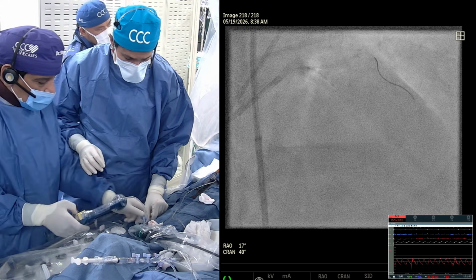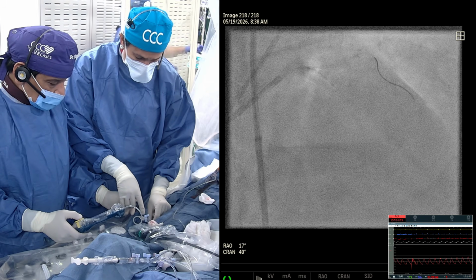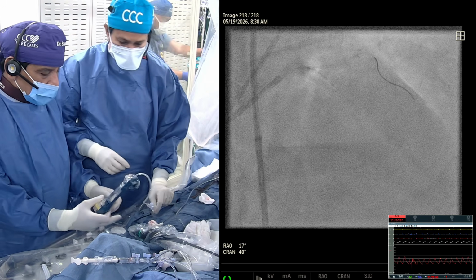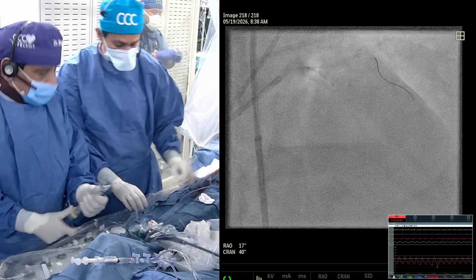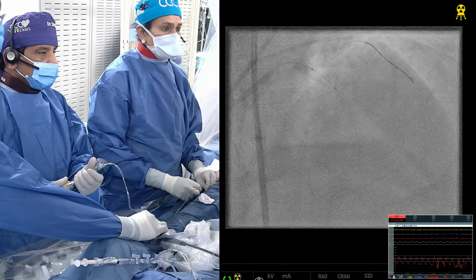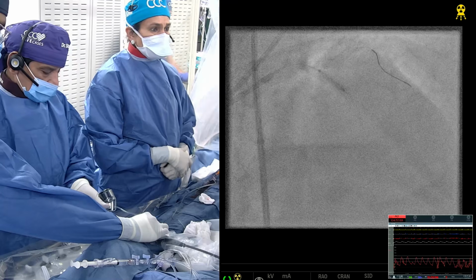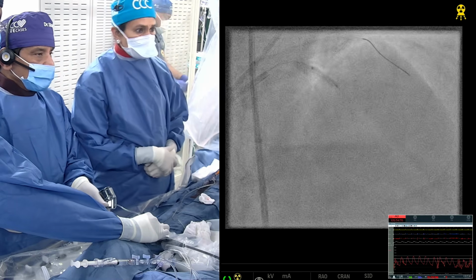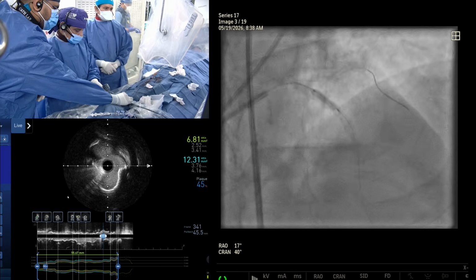Wait, one second. I know, the air bubble has to come out. You used to call it burping. The balloon burped. Okay. Good. Now we are going to go to 4. Ready? Go up. Good. It'll be interesting to see the cracks now.